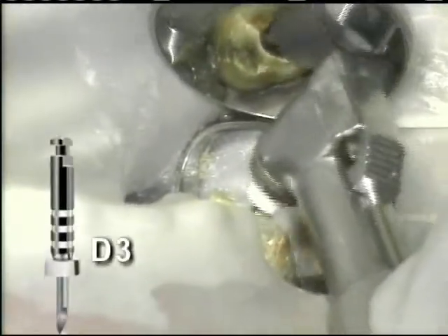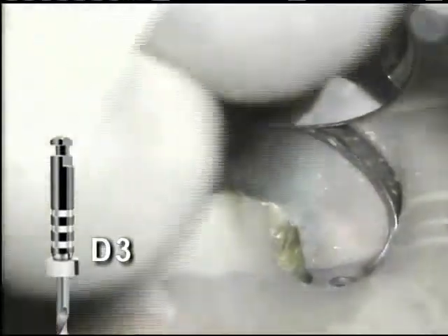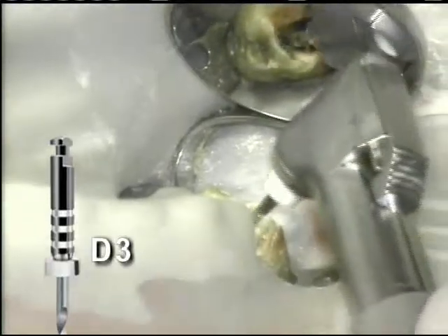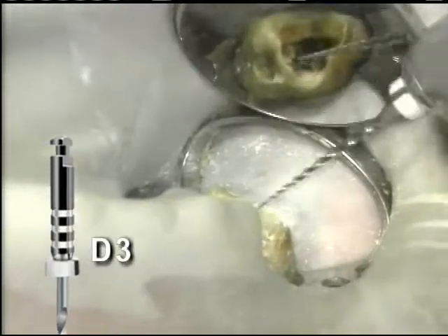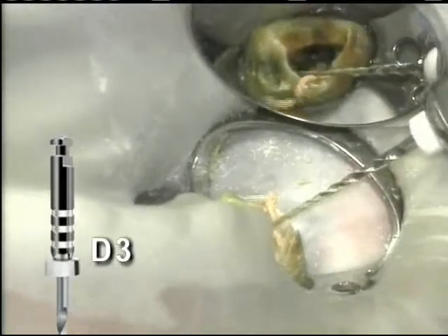The D3 is introduced in cases where deeply positioned obturation materials remain. Engage and remove as long as obturation debris continues to come out of the canal with the instrument.